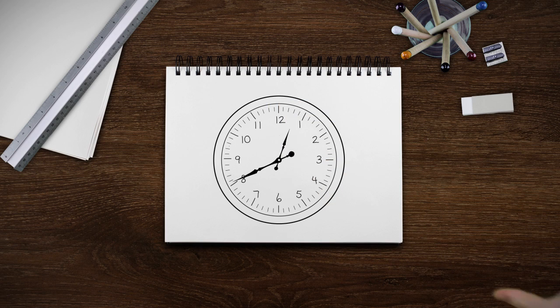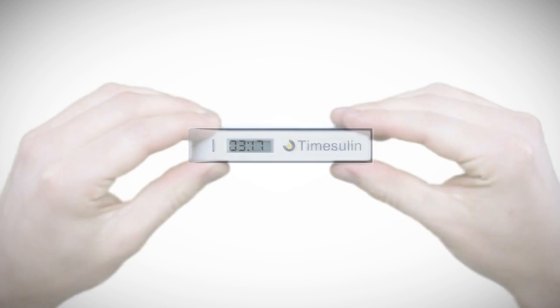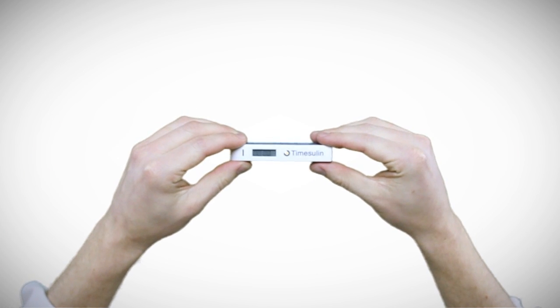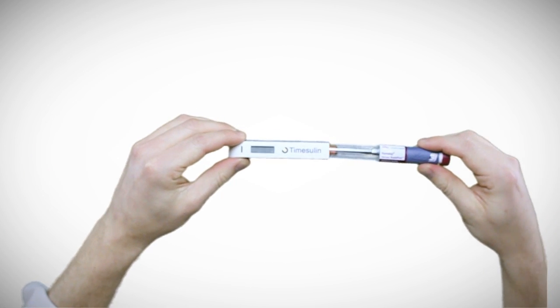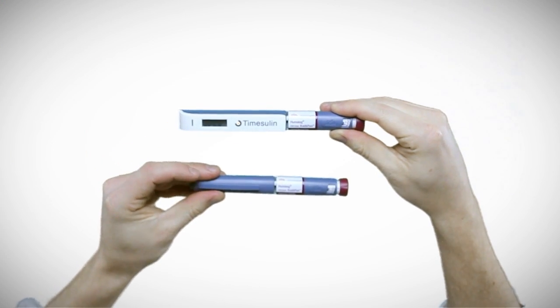That's why we created Timesulin. Timesulin is a timer-enabled replacement cap for your insulin pen. Simply put, Timesulin shows how long it's been since your last insulin shot, helping you avoid a dangerous accidental double dose.